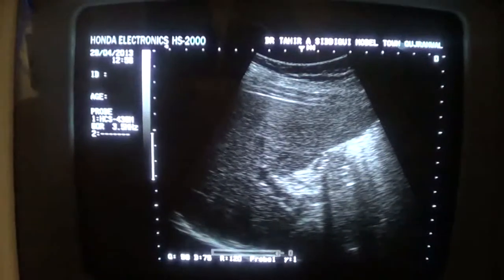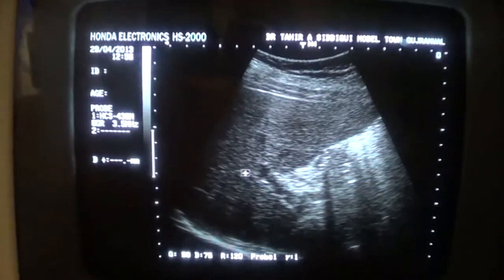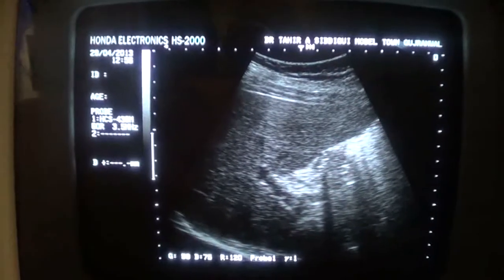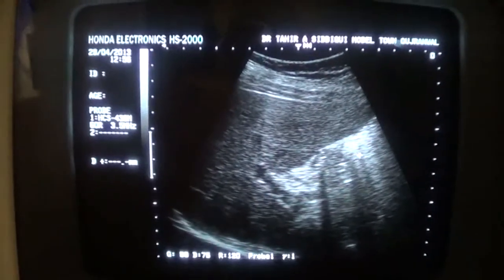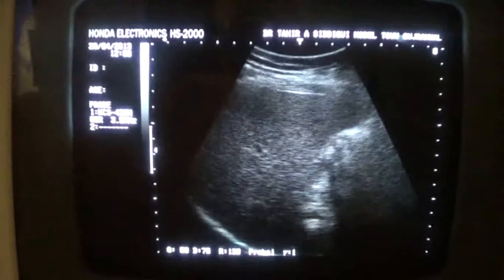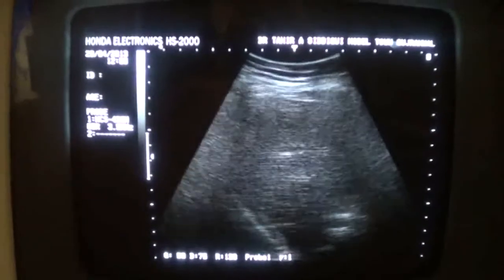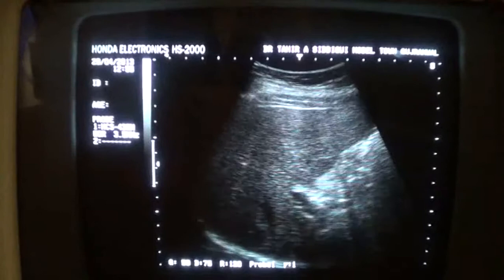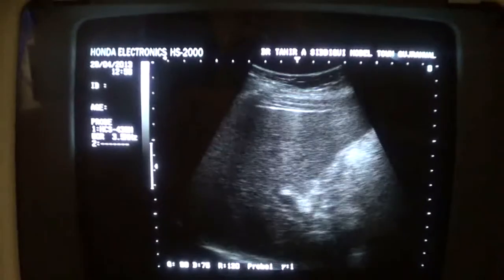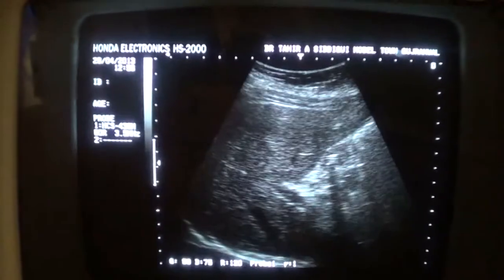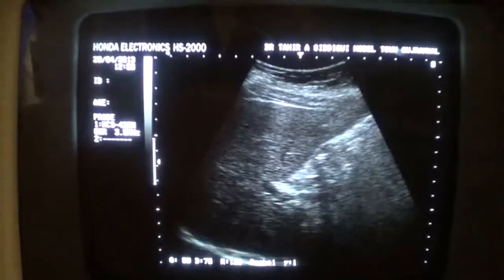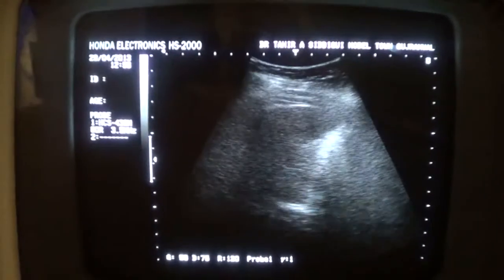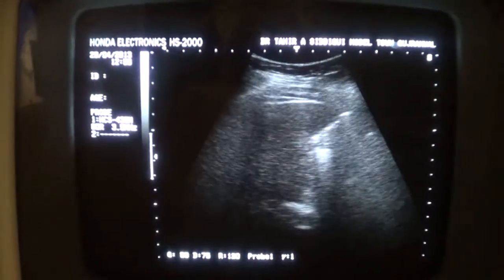Here you can see the gallbladder with its landmark, the portal vein. This is the gallbladder. Don't confuse it with the bowels. Be very careful while imaging a contracted gallbladder. Ask the patient to come the next day with an overnight fast.